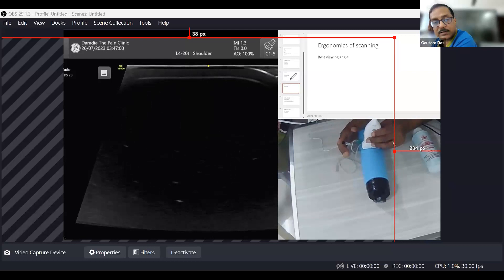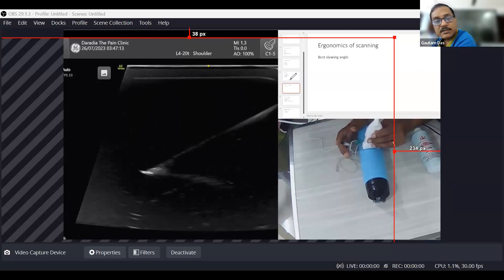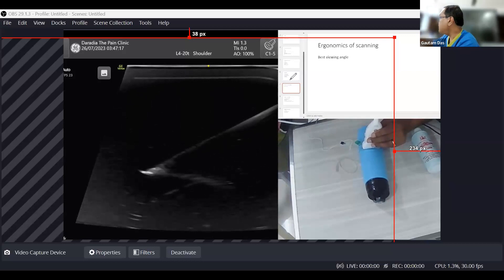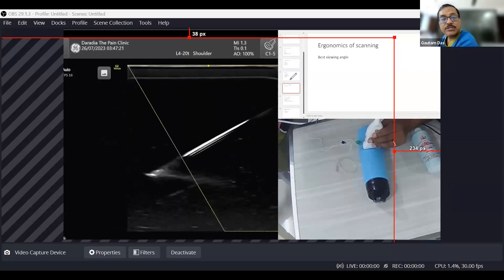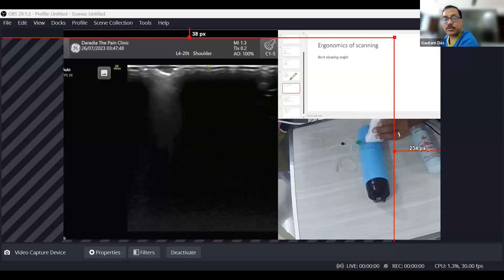A fourth technique involves machine software. Here the needle angle is more than 45 degrees and not very nicely visible. With this software, the ultrasound beams are sent obliquely so the needle becomes much better visible. Switching off the software makes it less visible again — some machines have this feature where the beam is manipulated to focus more perpendicularly toward the needle.